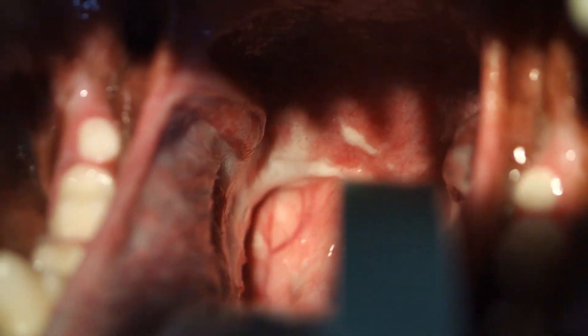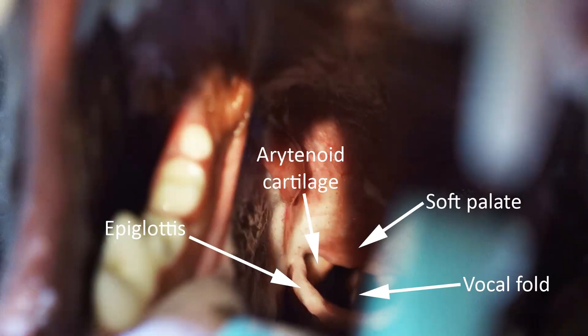We'll get the laryngoscope in and push it up the base of the tongue and angle it down so that we can bring the epiglottis forward. Just in front of that, we can see the whole soft palate has fallen back again, so we'll just see if we can push that back out of the way. Soft palate up. There's too much stuff in the way — it's tricky.